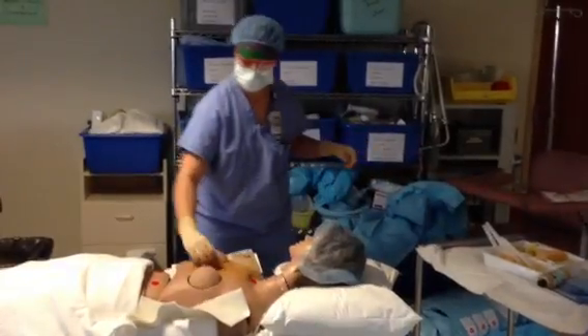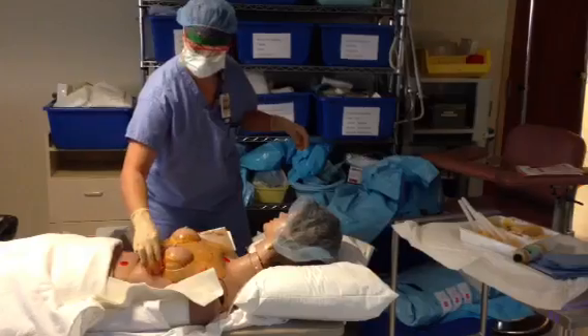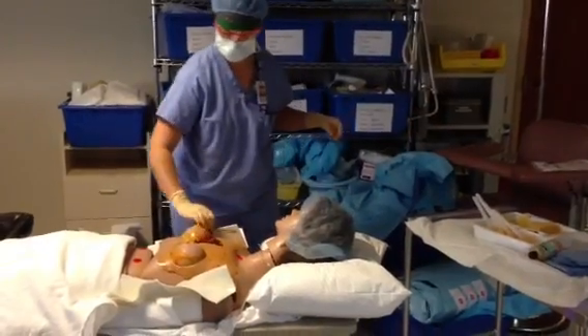After each sponge reaches the periphery you'll dispose of it. You always prep from clean areas to dirty areas.